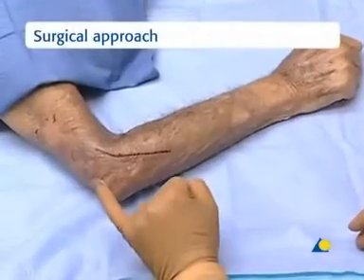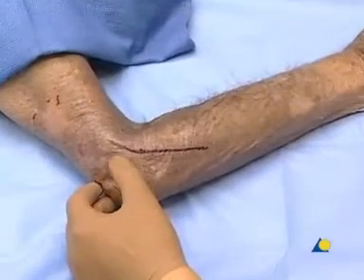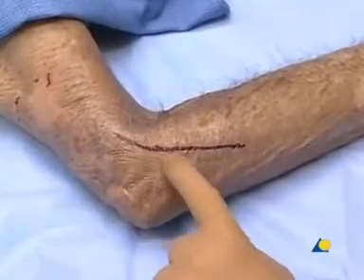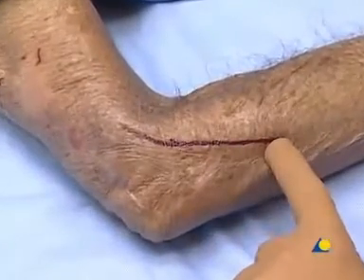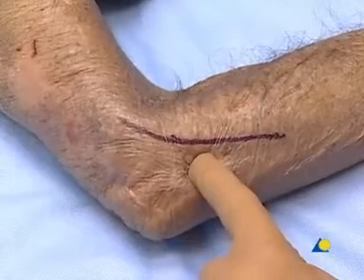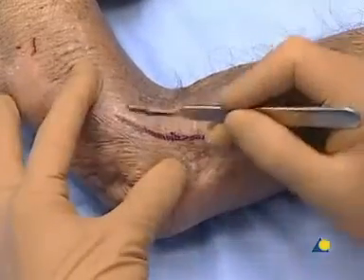The incision is drawn on the skin. For a radial head or neck fracture, the typical approach is from the lateral epicondyle across the radial head and neck and then down more distally. This approach is a bit more anterior than a standard Kocher approach, which would allow access only to the back of the radial head.